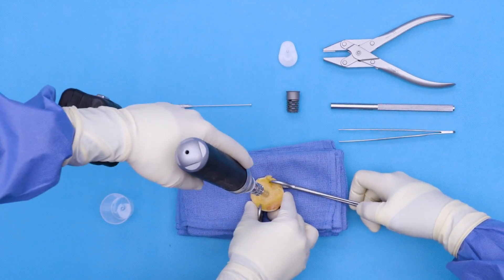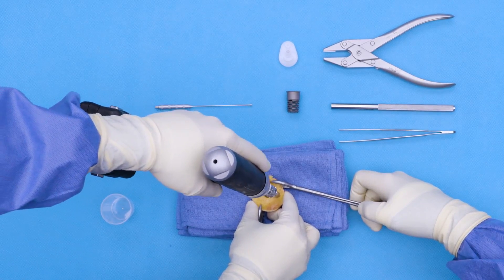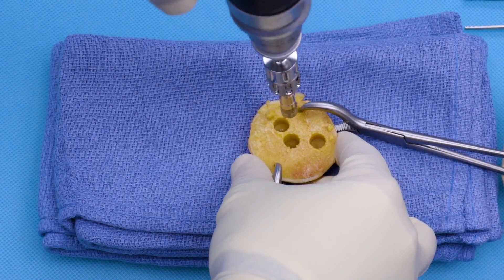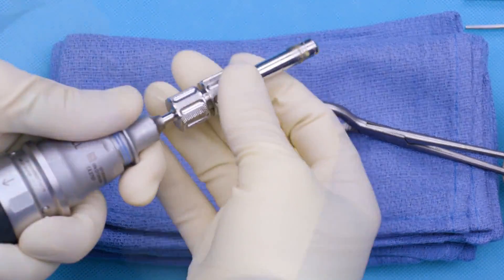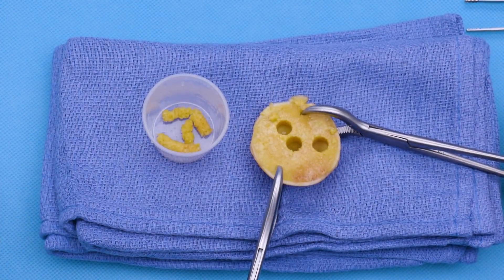The next step is to go ahead and harvest bone graft. I can disassemble and bring our bone graft into a little specimen cup as such.